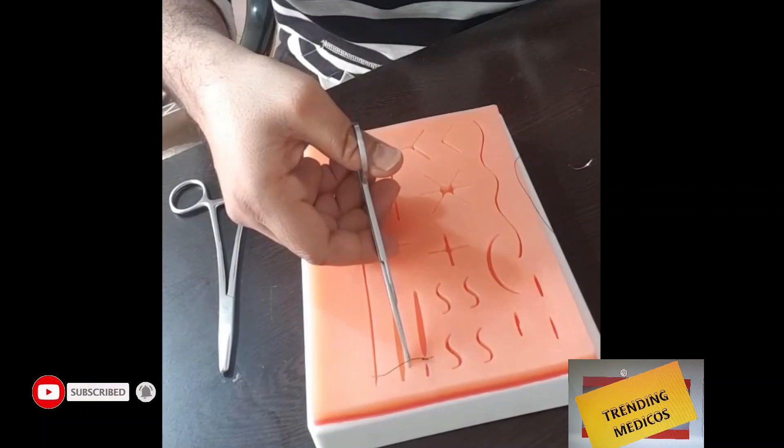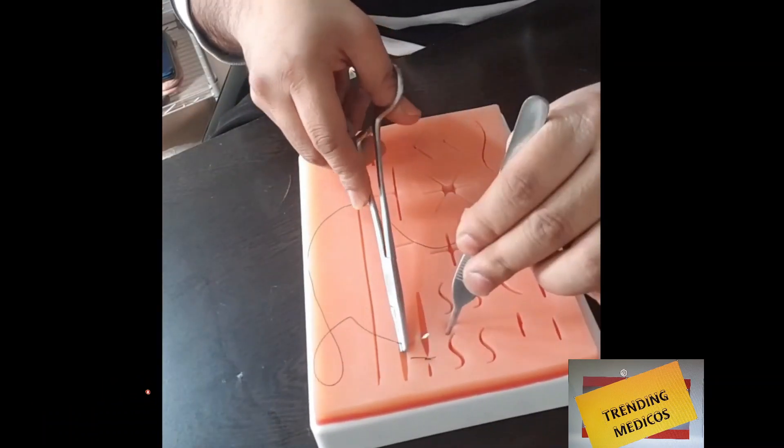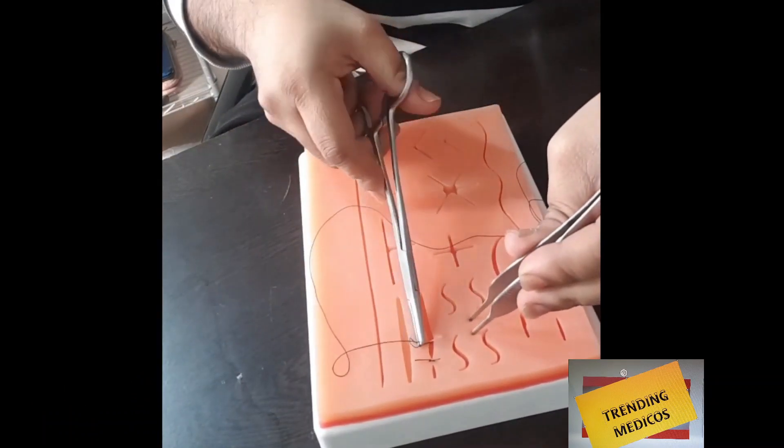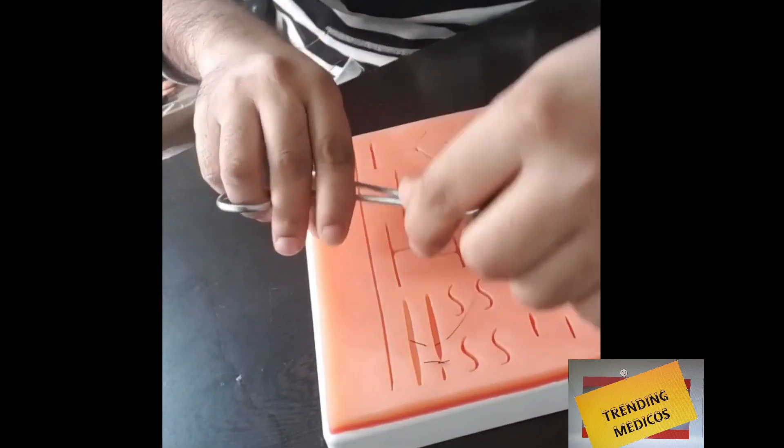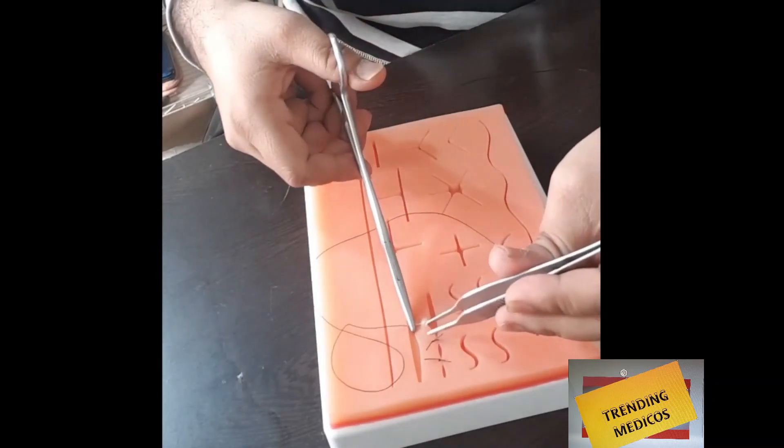Continue like this throughout the length of the incision or laceration. For patients, you should do it through the whole length of the clean lacerated wound, following the same movement.